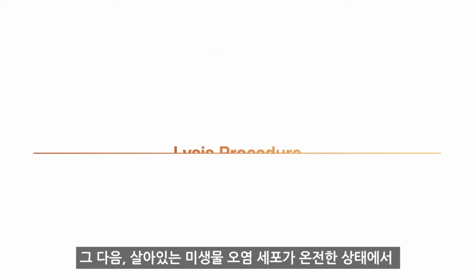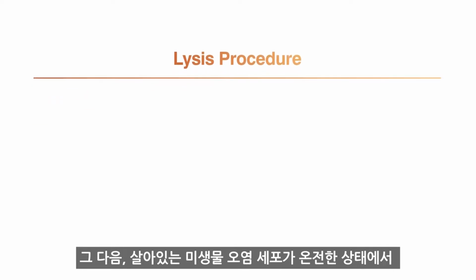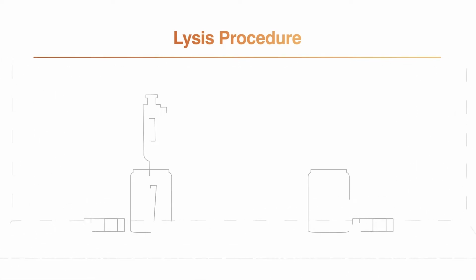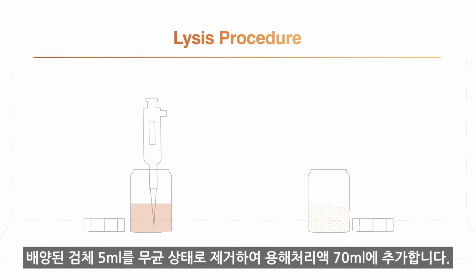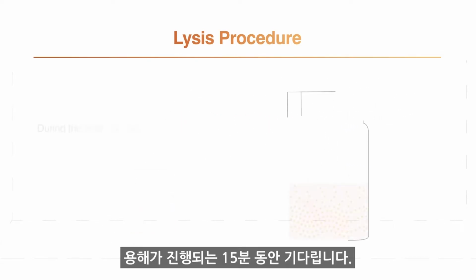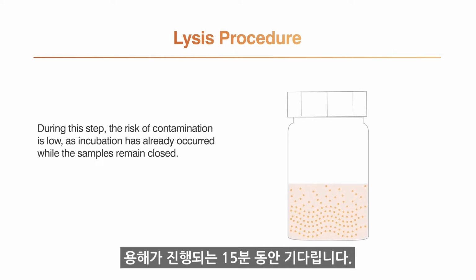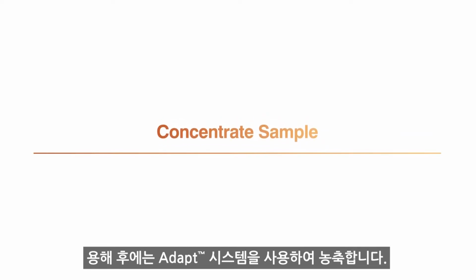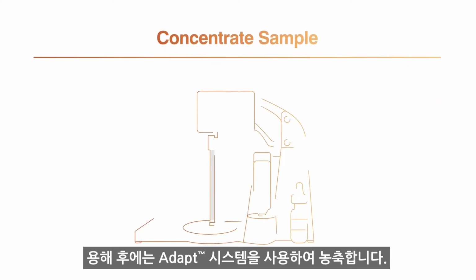Next, perform a lysis procedure targeting the product's cells while leaving microbial contaminant cells intact. Aseptically remove 5 milliliters of incubated sample and add it to 70 milliliters of lysis treatment solution. Wait 15 minutes while lysing occurs. After lysing, it's time to concentrate using the Celsis Adapt.